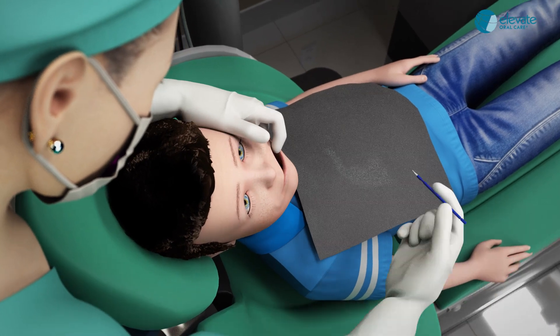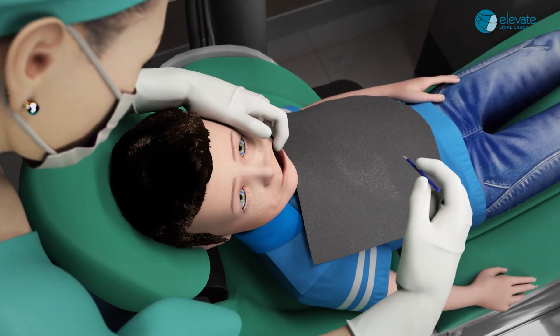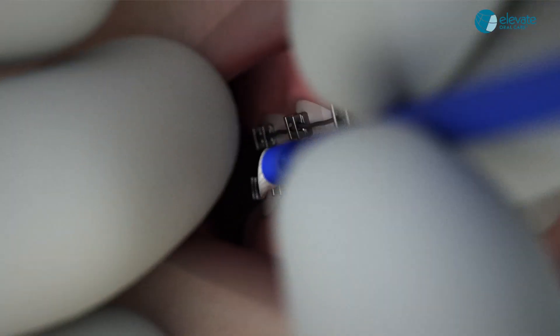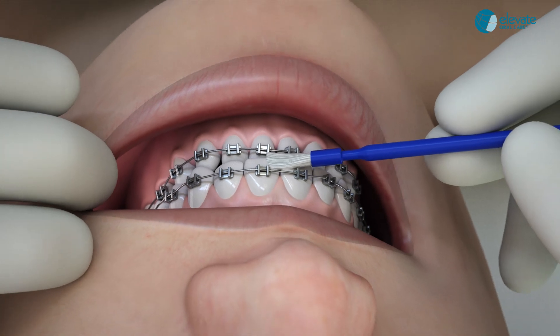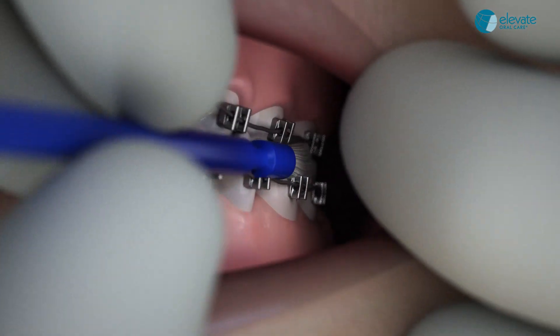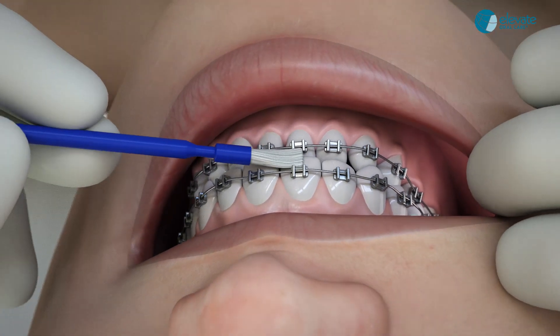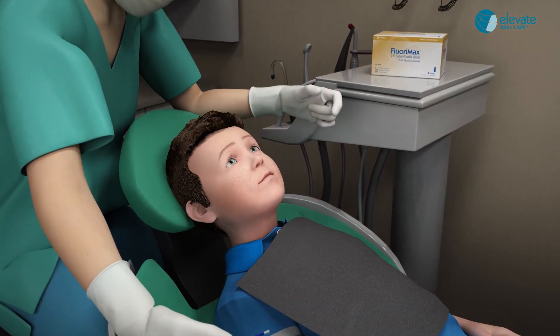Ortho application. Have the patient bite together and paint one quick swipe on the bite line of the facial surfaces from posterior to anterior, allowing the bristles to touch both upper and lower teeth in one half of the mouth. Then re-wet the brush and paint the other half of the mouth on the bite line. One swipe per side. Do not over apply.